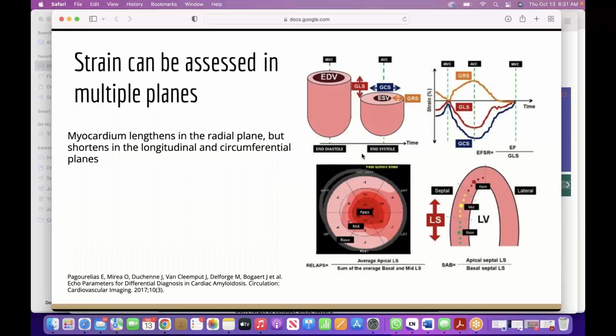One of the challenges with strain is that it involves different software and packaging from the people who make that strain analysis software, and that might not necessarily be transferable between different centers. So it can make strain analysis numbers difficult to compare from center to center.